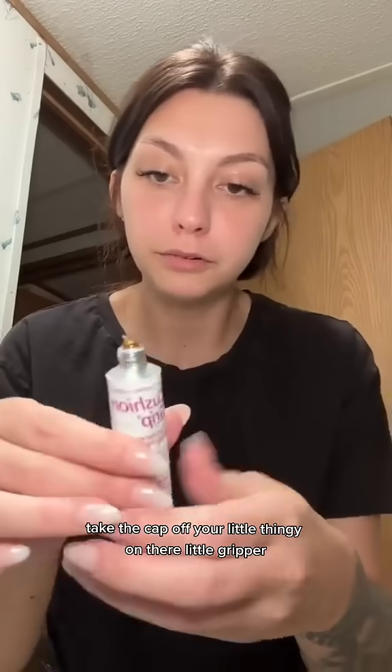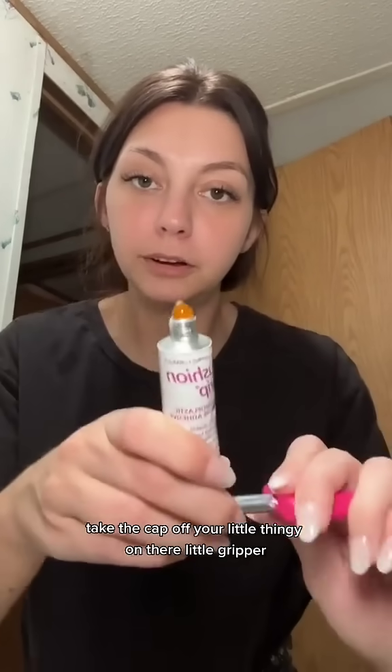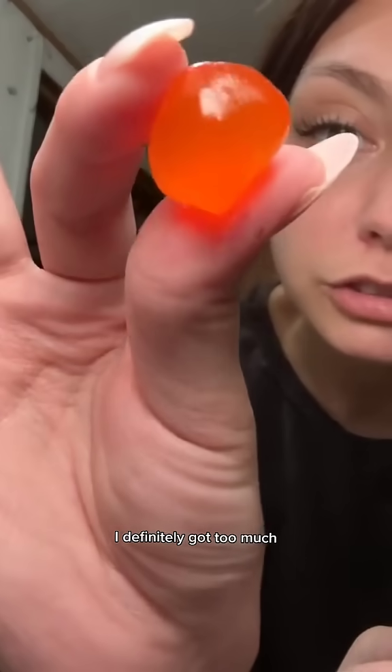Take the cap off. Put your little gripper on there. This is what it looks like. I definitely got too much.